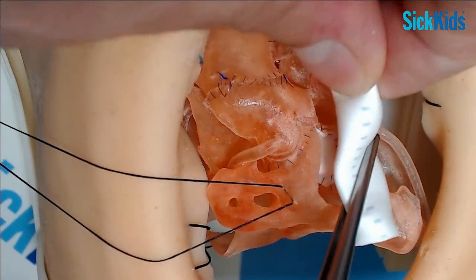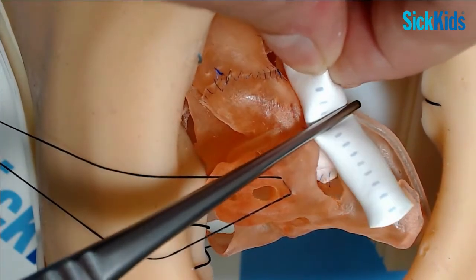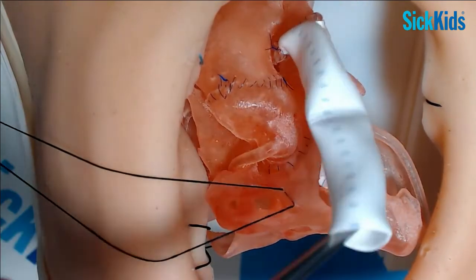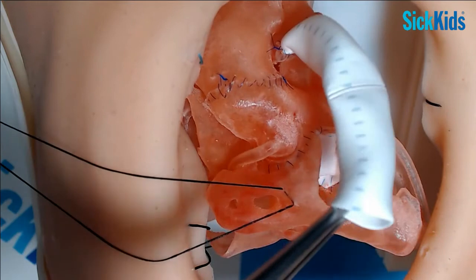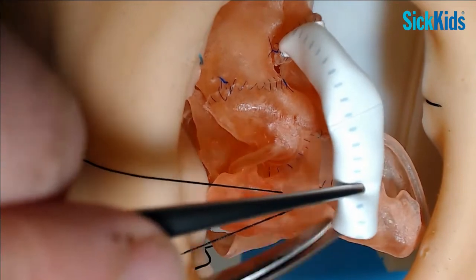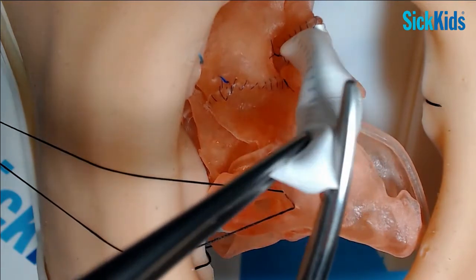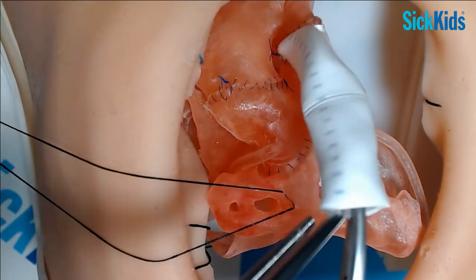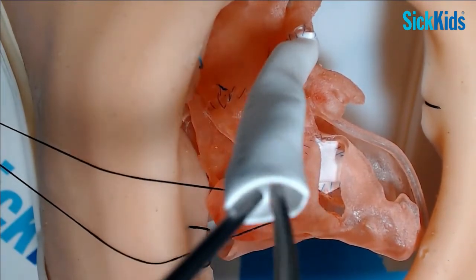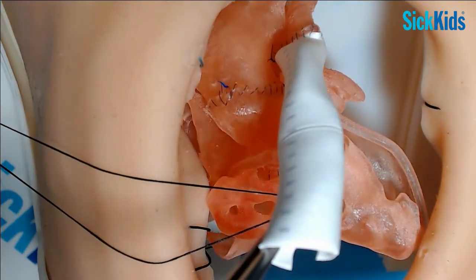You want it to be loose but not redundant, so probably about there is long enough. So I often mark it with my forceps. It leaves a kind of imprint. As you can see, where your heel wants to be like that. And you don't want it too long, so you can match the toe to where it wants to be there. That's probably enough. And then you want to be straight at the inside to where your mark is there. You don't usually, with these little conduits, need to cut anything away, but you can if you want to. You can cut a little piece out the back.